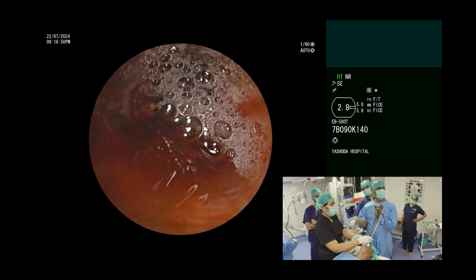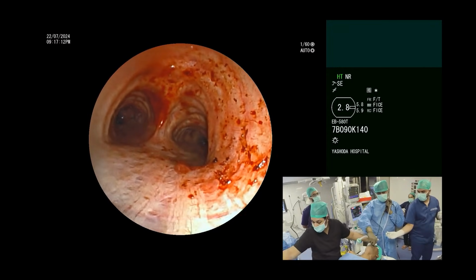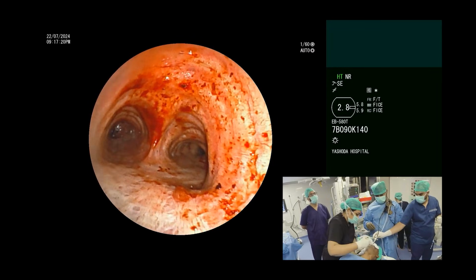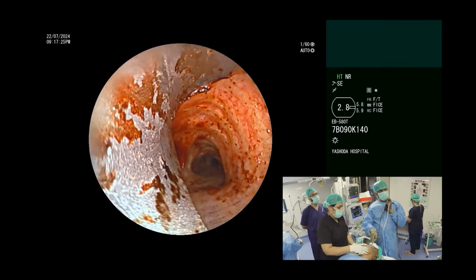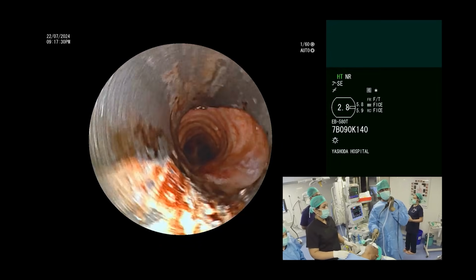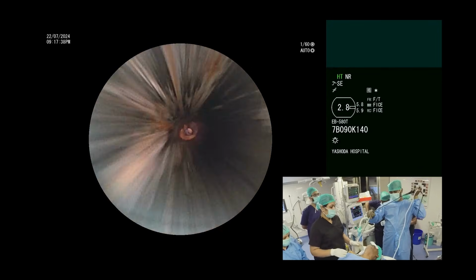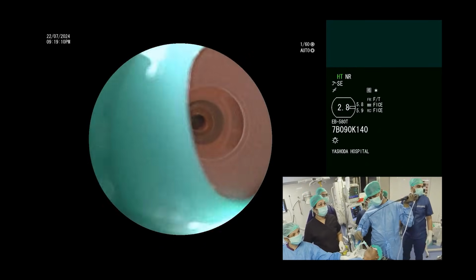The primary objective of recanalization of the airway as well as the debulking of the tumor is pretty much achieved at the end of the procedure. Now, as you can see from here, I am doing a check bronchoscopy to make sure that there are no remnant tumor fragments which are left in the airway. And you can see that I'm using the corkscrew motion to gently remove the rigid bronchoscope from the airways, so that we do a repeat check bronchoscopy once the patient is put under LMA again. So the rigid bronchoscope is removed from the patient.